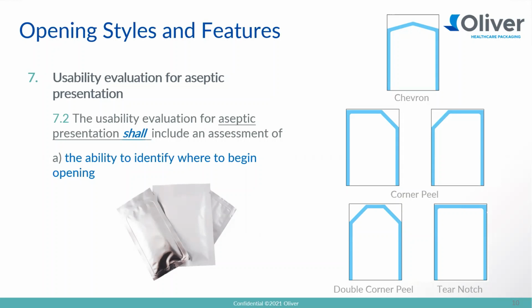And then finally, for weld pouch applications, where substrate is well bonded to another, we have a tear notch application whereby you can physically tear open the pouch to remove that product from its primary packaging. So Tommy, basically what you're saying is the design of the opening features are telling you where to open the pouch, correct? Yeah, exactly, Jeff. It's not always clear to everybody. Some people take things for granted. So I suppose the key here is to try and point the end user in the right direction at least.